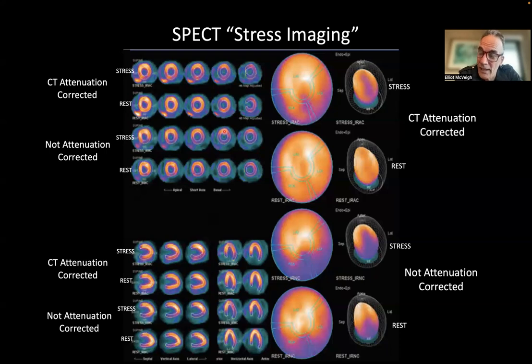If you reboot a scanner, it will spend 20 to 30 minutes scanning at different energies and recalibrating the detector, so it knows how sensitive it is in these bandwidths. And I'm not sure you'd ever be able to get those calibrations. You might.